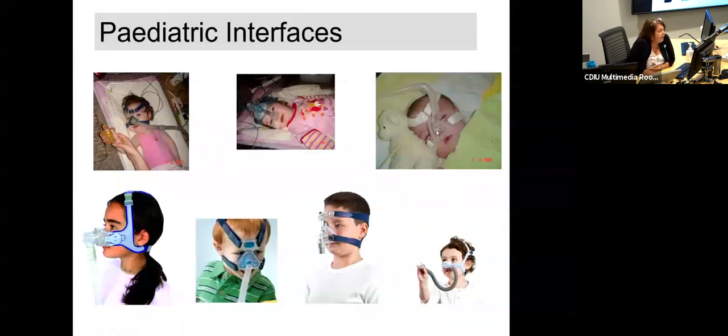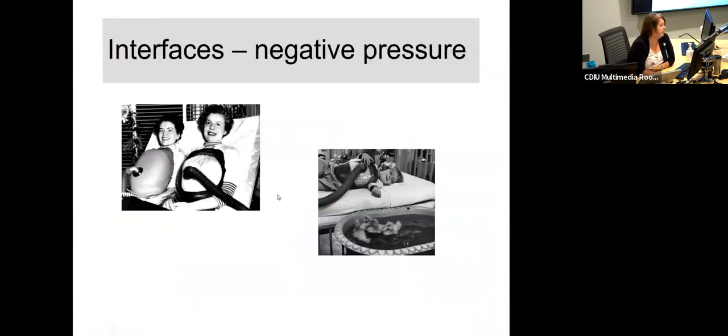Here are some other interfaces. So there's the smallest size here. There are some of these that are designed for home, and they're kind of nice, but they're hard to fit. And some manufacturers try very hard. I'm not trying to have you sold on any particular device. Anything that works is what you should use, and things that you're familiar with is what you should use.